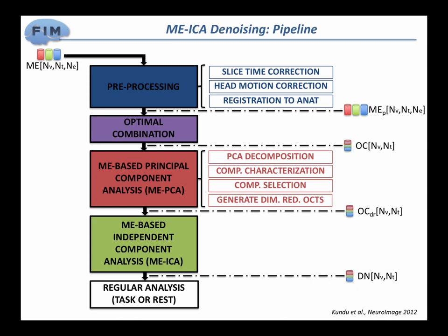I don't know if there is any AFNI person here, but they're working on afni_proc.py, integrating this into that. So one thing you can do is you run all this without having done your filtering. You get your time series that are bad. You also have your other regressors, like due to motion and a couple other things. And then on the actual final program, 3dTproject, where you're going to remove all those components, you can actually do the filtering by feeding in all these sines and cosines. So there are different ways to do it.